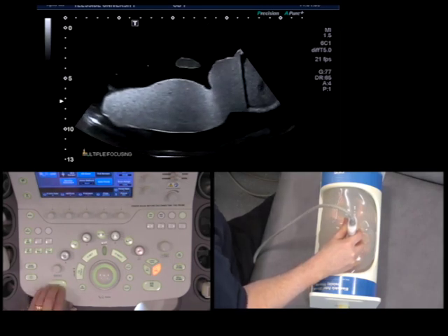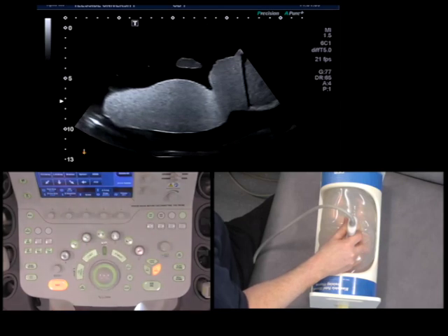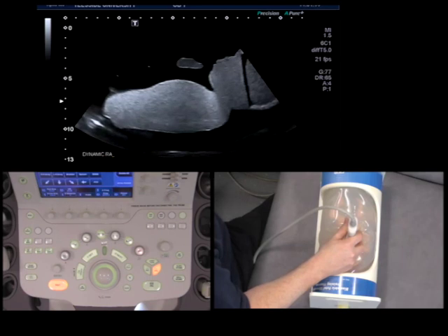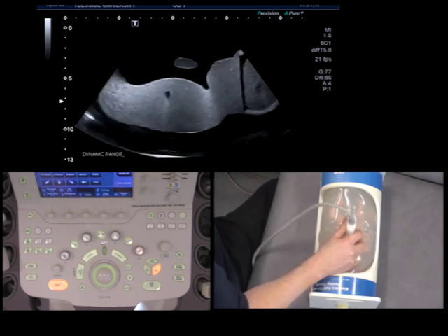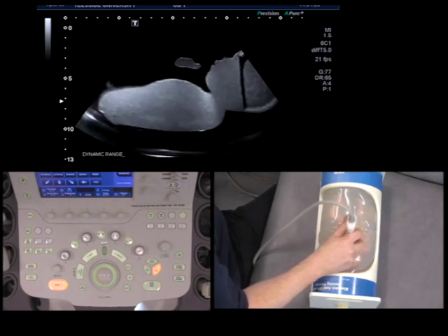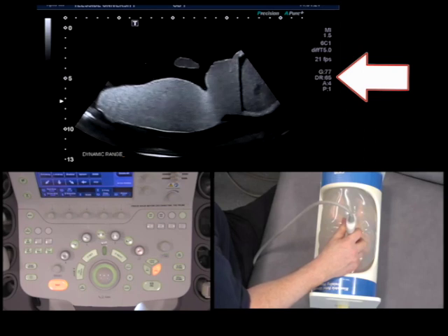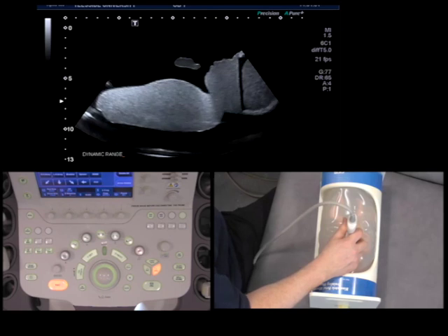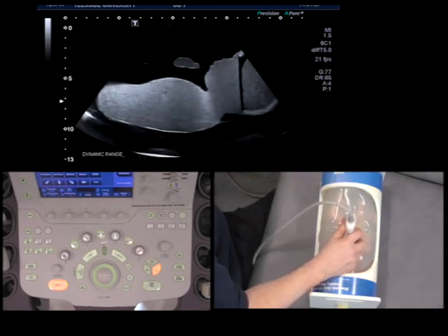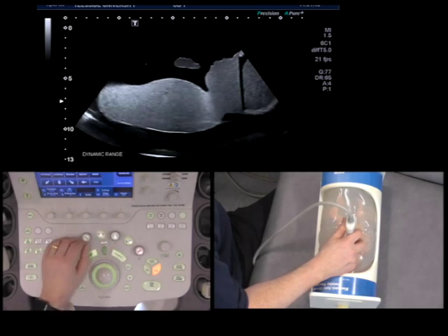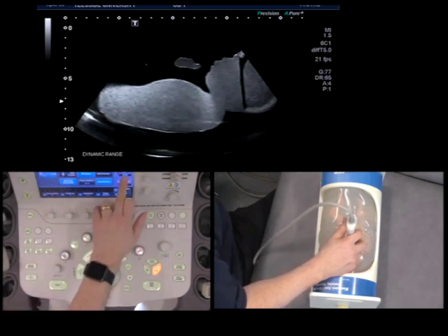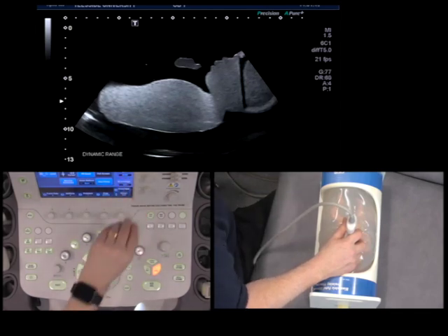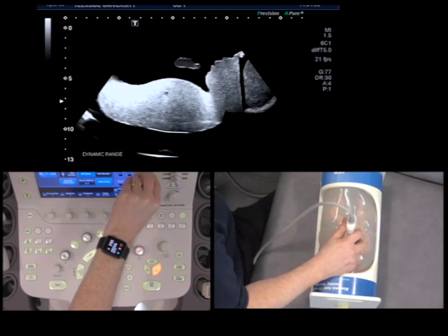Now let's talk about dynamic range. All of these returning echoes which come back to the probe — the machine has to decide whether it's going to make that image black, white, or grey. That's what the dynamic range does. It's this button here, and all machines will have it.